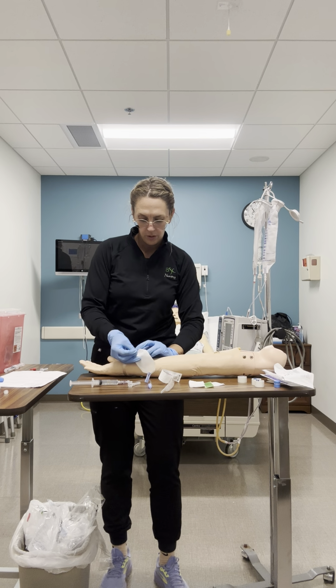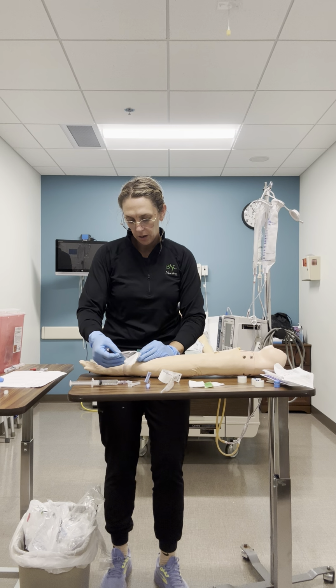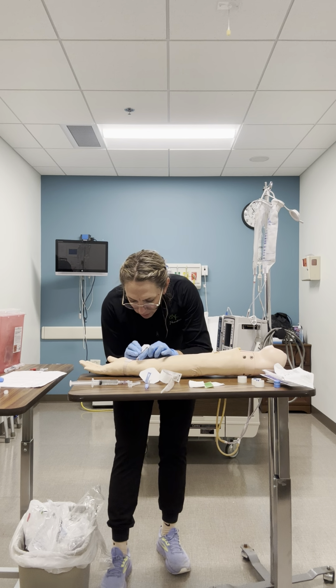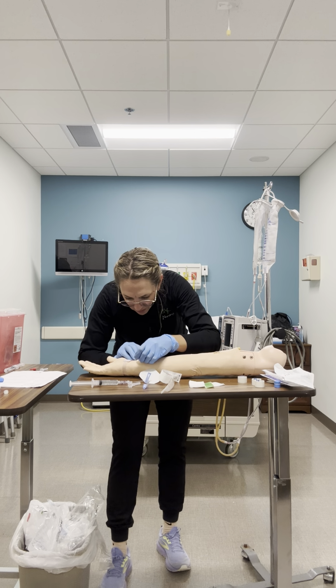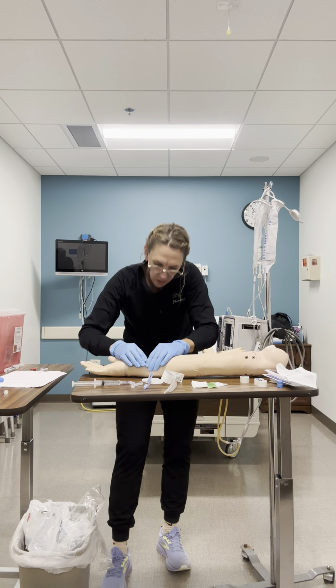And now I'm going to take my Tegaderm. I'm going to go up to the, just stabilize, sticking myself to the patient, stabilize the catheter.